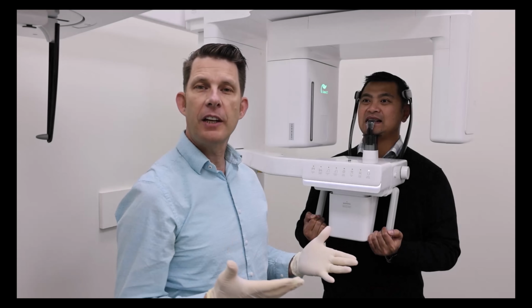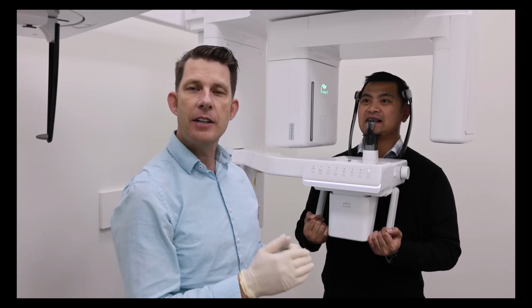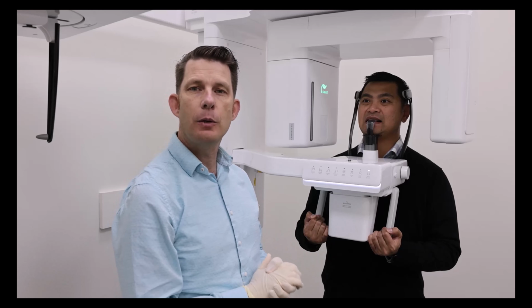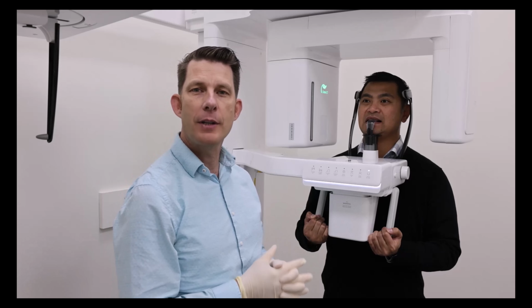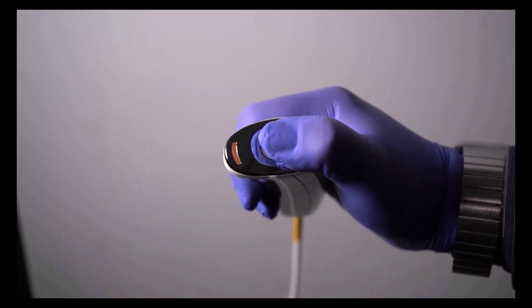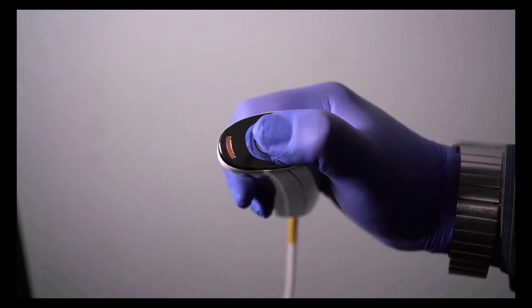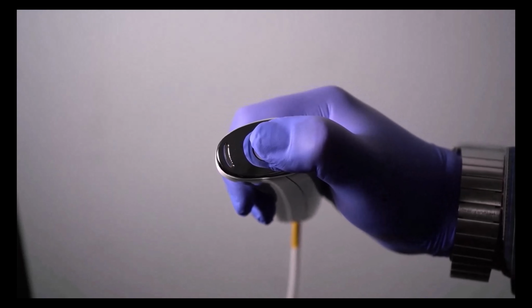We've completed our scout image, and I went over to the acquisition screen and adjusted the field of view as needed. Now we are ready to take the CBCT of the designated tooth. I'm going to step out of the room and we're going to complete the scan. Hold the button on the acquisition trigger switch, which will turn yellow when exposing. Hold the button until the image acquisition is fully complete.